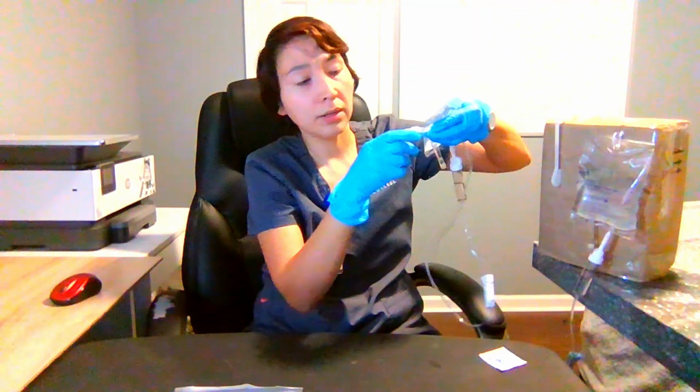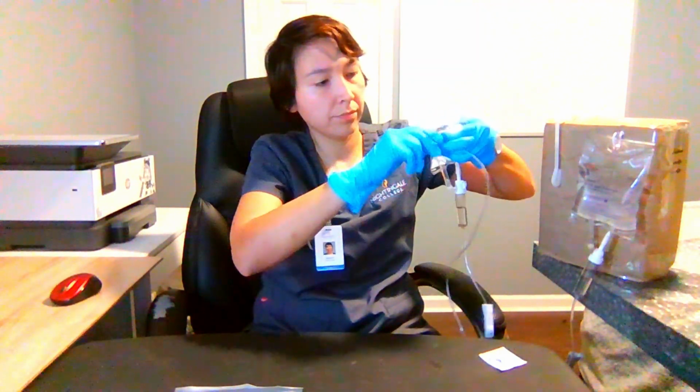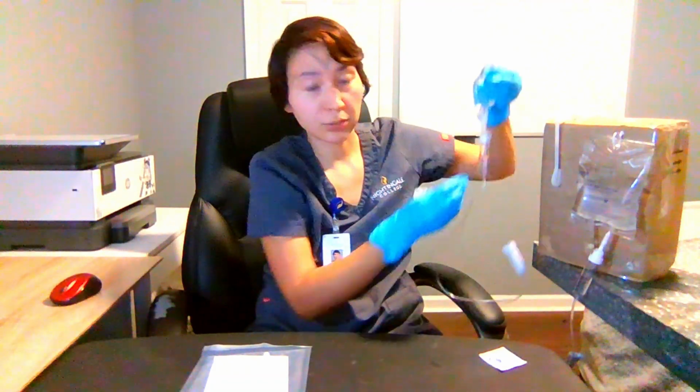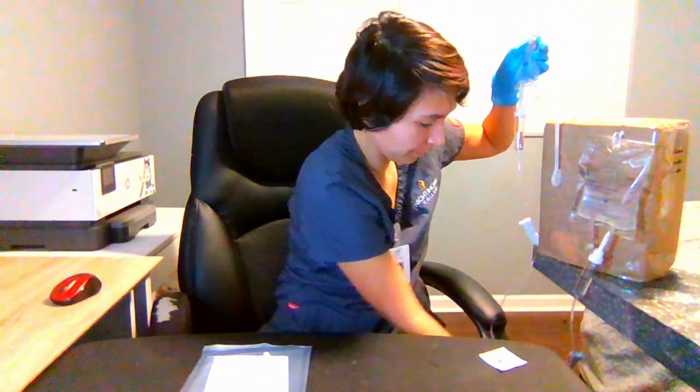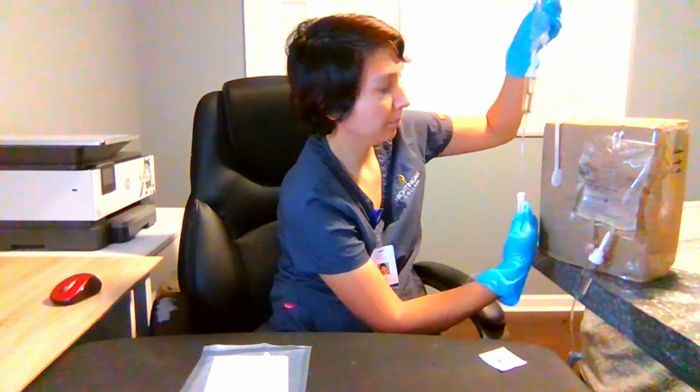I'll remove the adapter cap to allow a few drips to pass through, and slowly open the roller clamp.